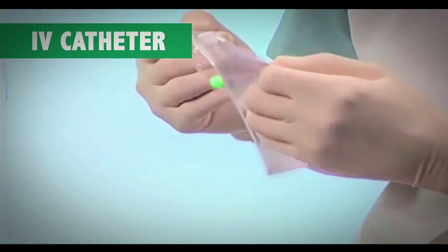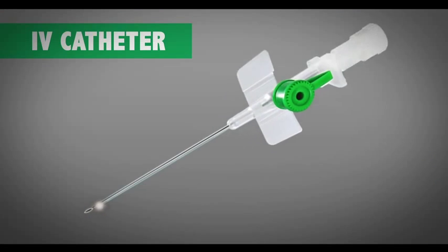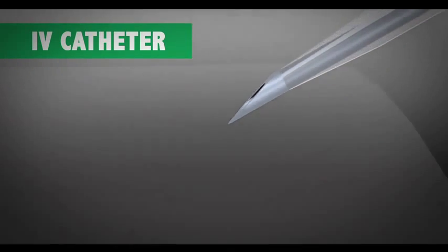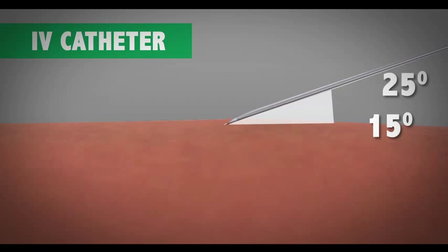Remove the cannula from the packaging and then remove its needle cover. Hold the needle bevel upwards and insert it at an angle of 15 to 25 degrees.